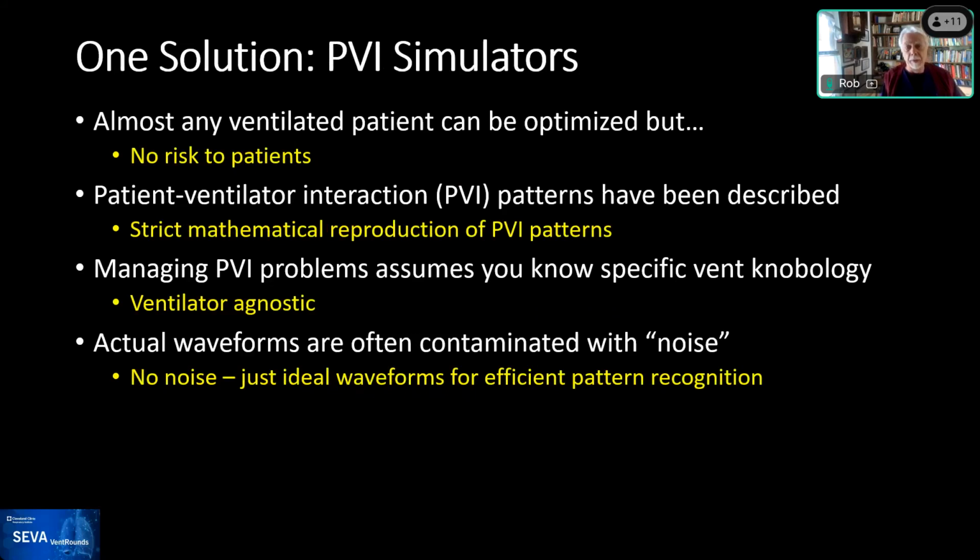So patient-ventilator interaction patterns have been described, as we said, and simulators are designed with strict mathematical reproduction of these patterns without any noise. Again, like I mentioned, they're ventilator agnostic because you can think of them as generic ventilators.